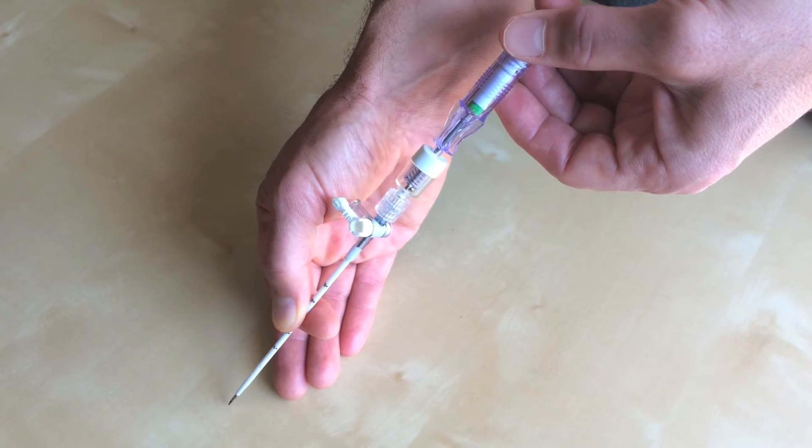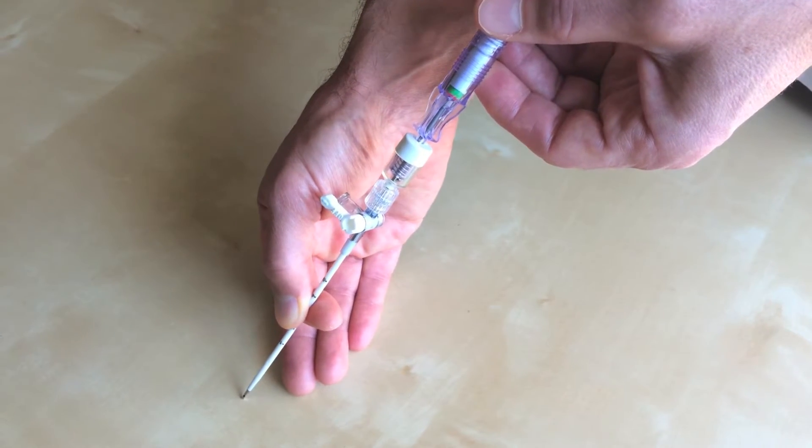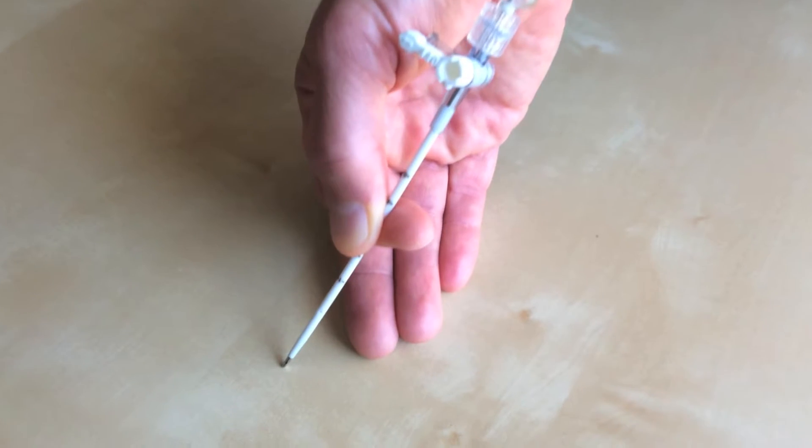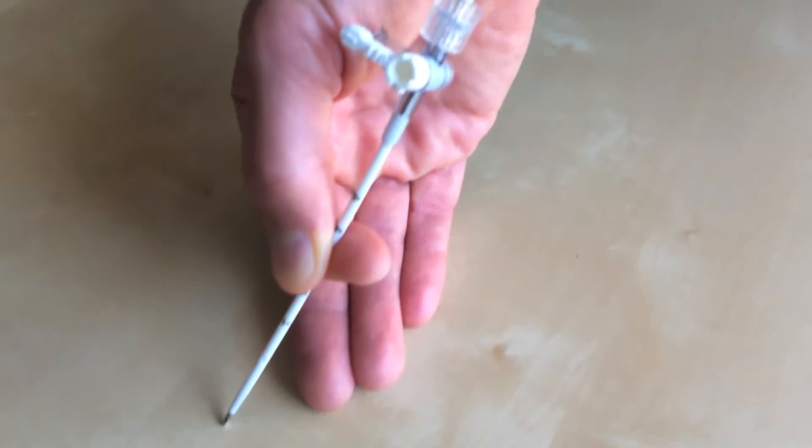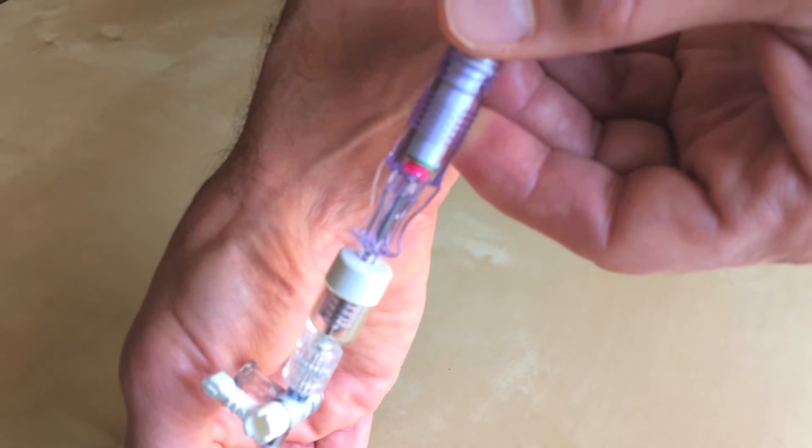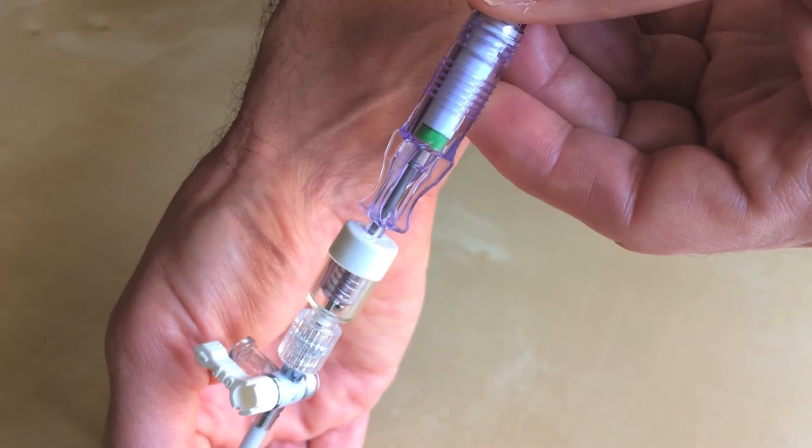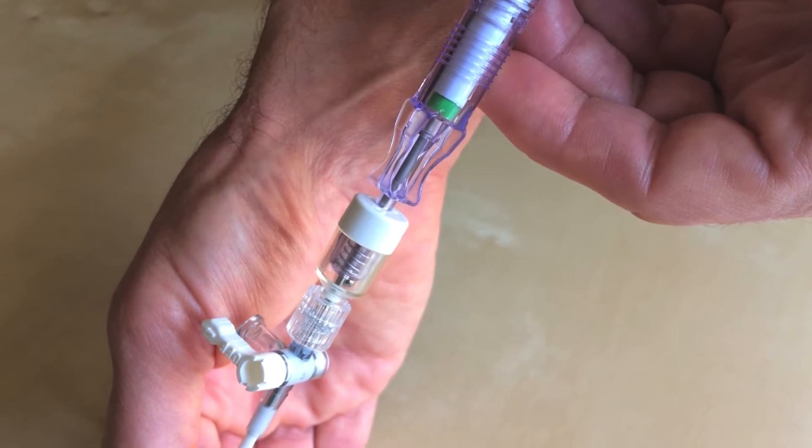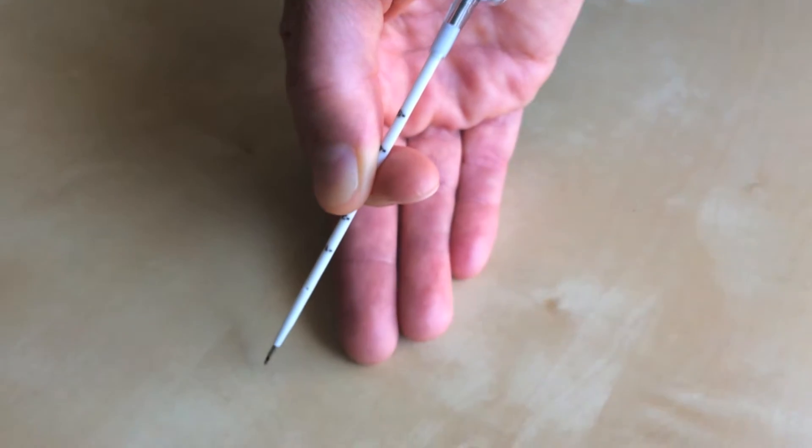When pressure is applied to the tip of the needle, the blunt end retracts exposing the sharp end and the indicator changes from green to pink. When pressure is released off the tip, the blunt end extends and the indicator changes from pink back to green.